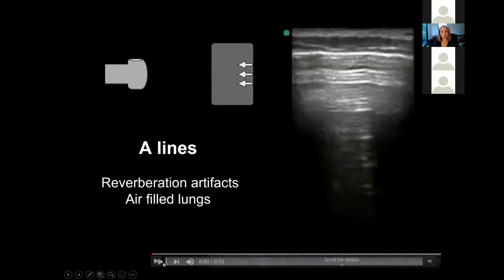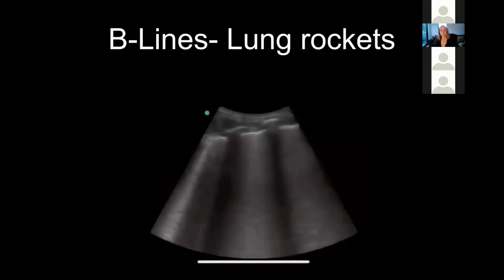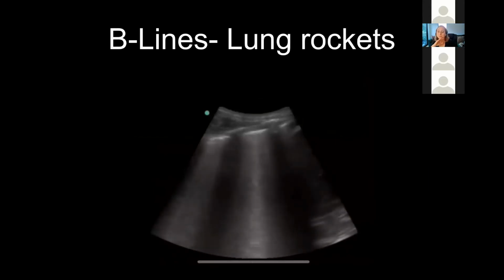I'm not sure it's going to play. Never mind. Okay, so B lines.